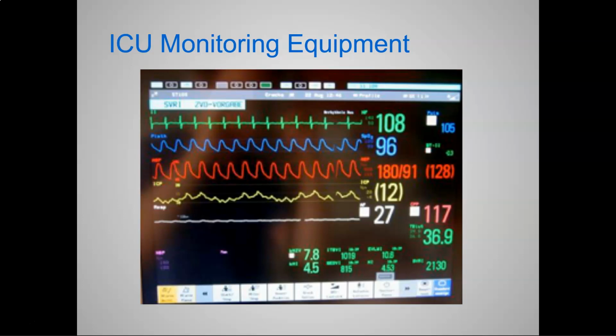We're going to look at the waveform and what parts of the waveform are relevant to us and what they mean, more importantly. Because believe it or not, just like an EKG or an ECG, we have different portions of the wave that mean different things, such as the systolic phase versus diastolic phase. And we will talk about the dicrotic notch and all that, so don't worry. But that's a second by second update. Arterial pressure, 180 over 91, slightly hypertensive.